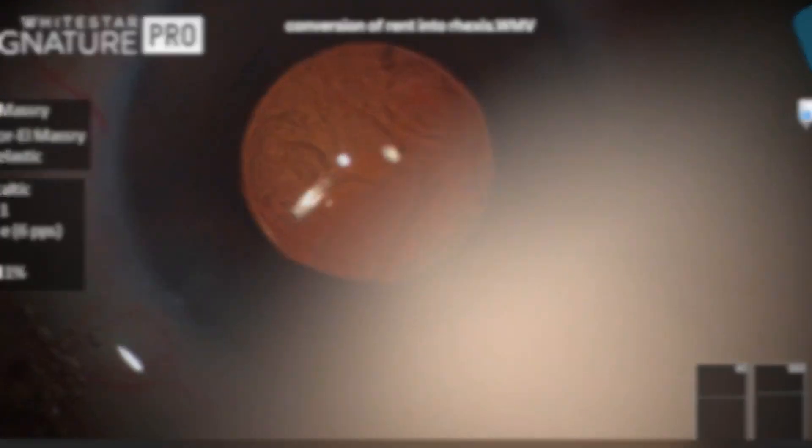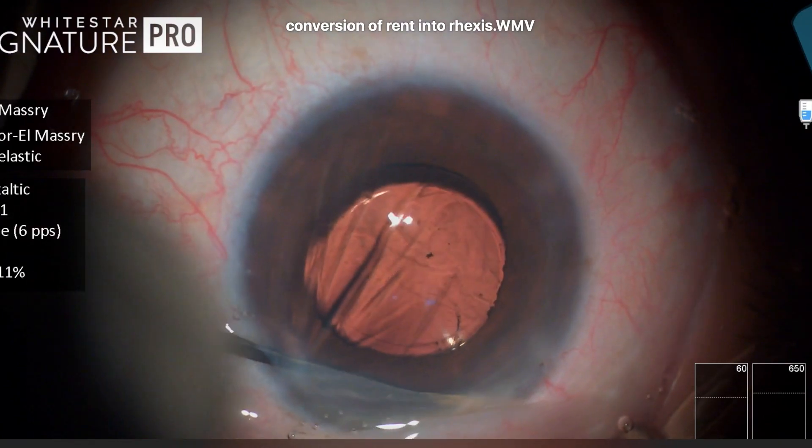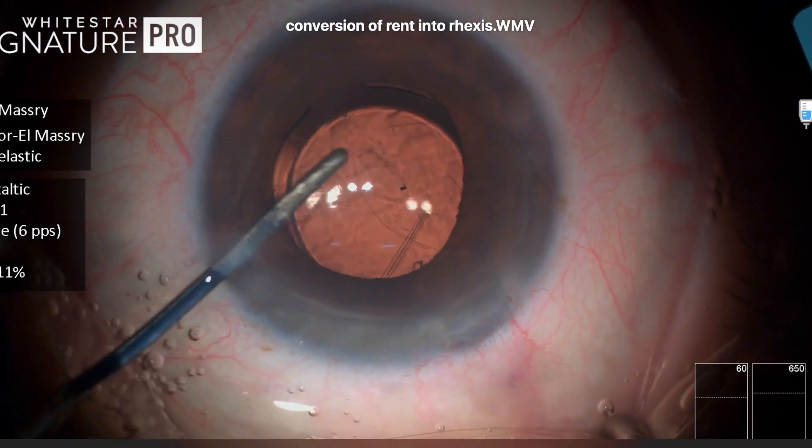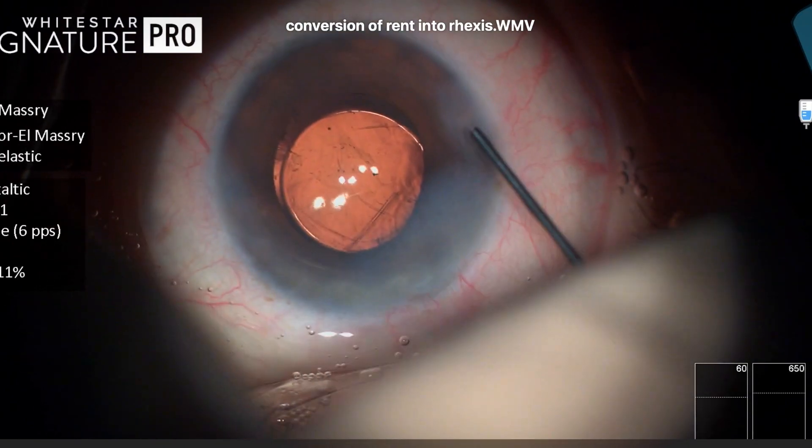The next step is to sweep through the wounds to be sure that there is no vitreous coming out from behind the IOL. Then some stromal hydration and the case is concluded. Thank you so much for watching and waiting for your comments.